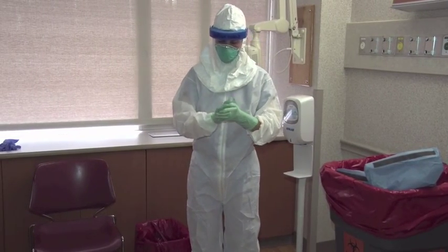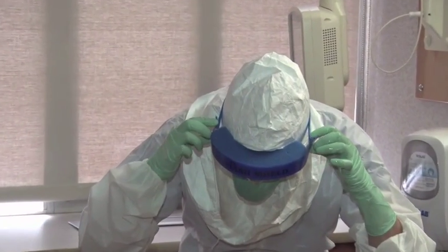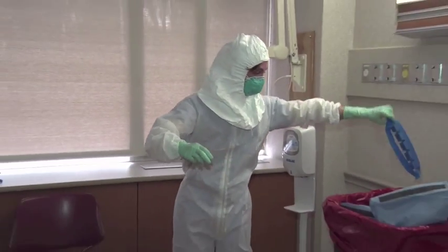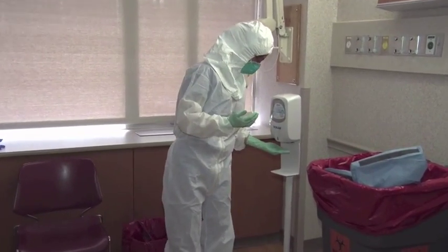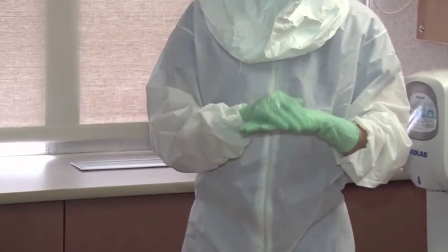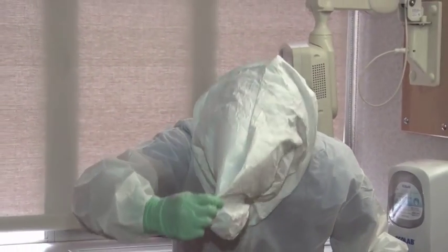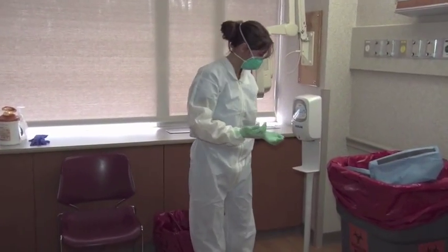Remove the face shield by tilting the head forward, grabbing the sides of the elastic band near the temporal area, and slipping the strap off the head. Inspect and disinfect the inner gloves. Remove the hood by tilting the head forward, grabbing the top, and pulling off and forward with one hand. Inspect and disinfect the inner gloves.